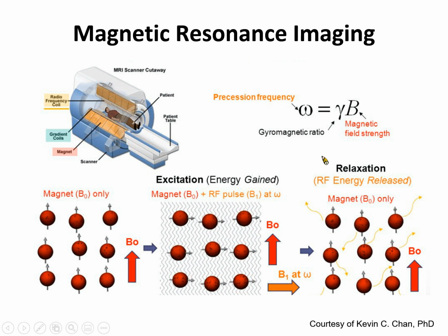ultimately it is a radiation. But the MRI machine does not have radiation. That is a very important difference between the MRI machine and the X-ray type of machine, for example, the computed tomograph. So this is just the basic principles of magnetic resonance imaging.